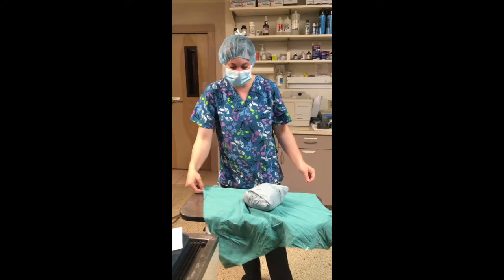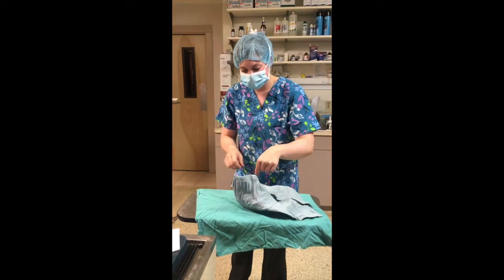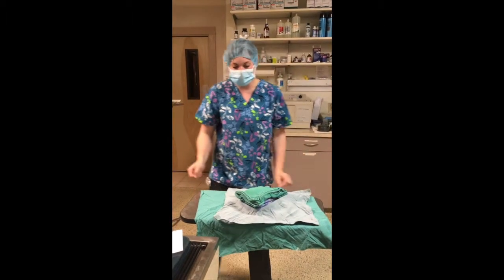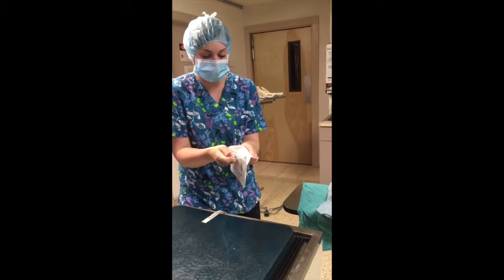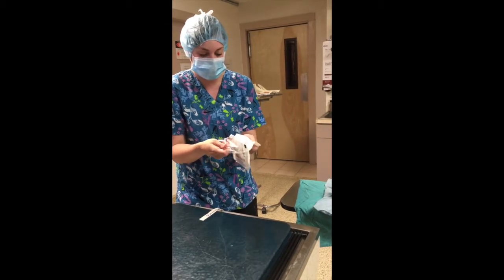That one is open. I'm going to go ahead and open up the second one, making sure I do not touch the inside. Okay, so now that that's open, I want to go ahead and open up my gloves, making sure not to touch the case of the gloves inside there because that will be sterile, and we're going to dump that onto this.